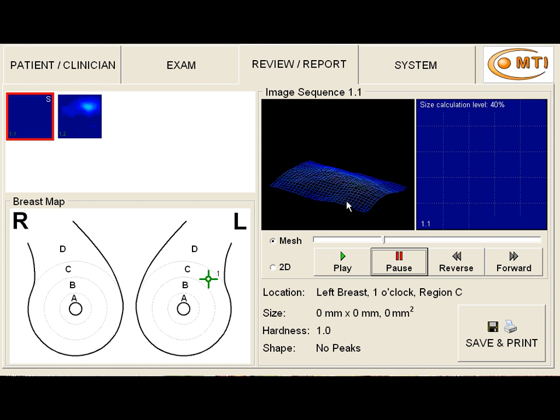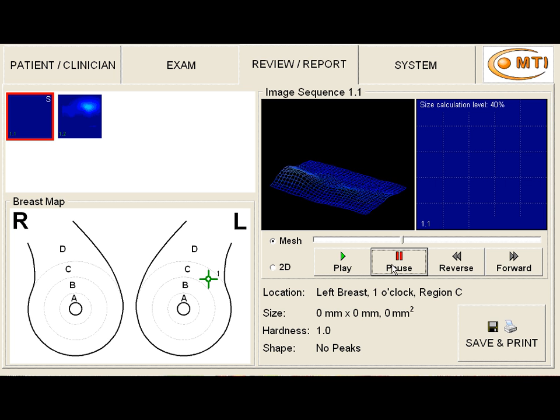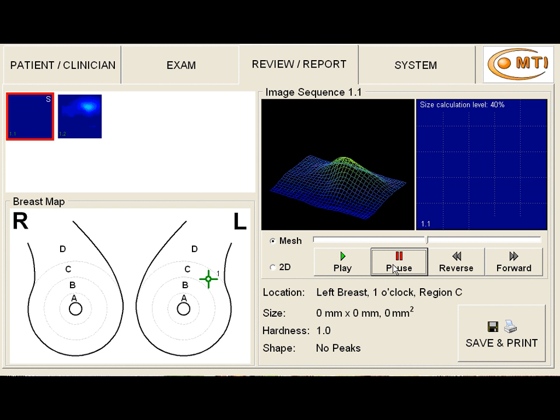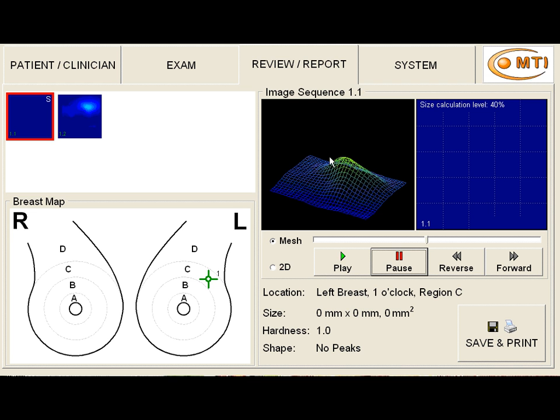And we go back and forth. These all look the same. And then as we come back again, there seems to be a larger wave right there. Now this, if it was consistent, we might call a mass, a lump. It is certainly higher than the surrounding area on examination. It's higher than all the other small ripples or waves that we see as we screen this area. And it seems to have a certain shape and a certain size.